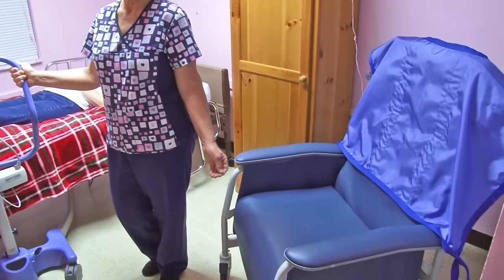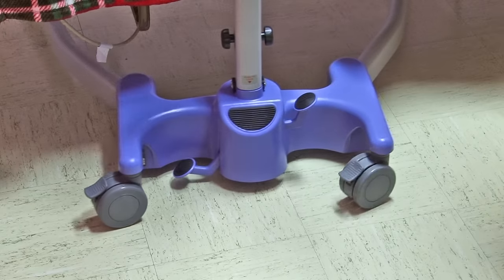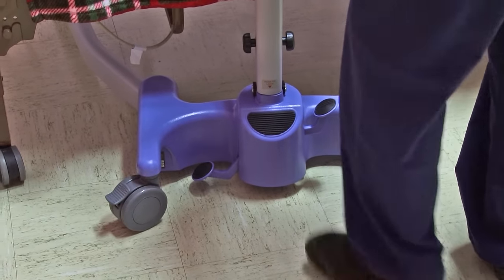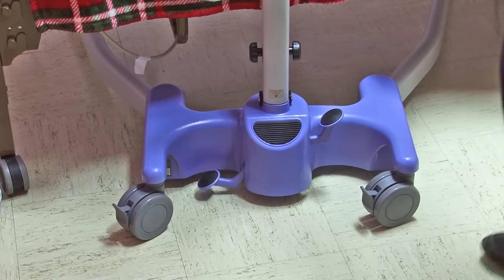The wheelchair or the Jerry chair will be placed in the proper position for moving the resident. We want to make sure that we stabilize the unit. You want to have everything locked down in position tightly, and then check it after you lock the wheels. Okay, that is locked.